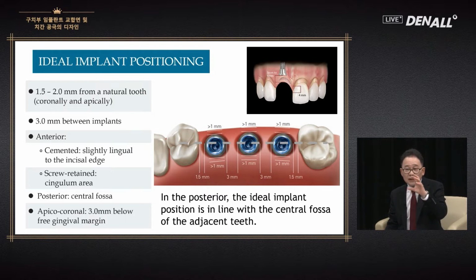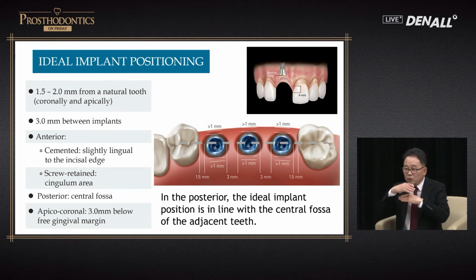Surgery cannot be done ideally. If the oral environment is very good, the teeth would not go missing. Bone is resorbed and the tooth positions are not very good, so implants cannot be placed in ideal positions.